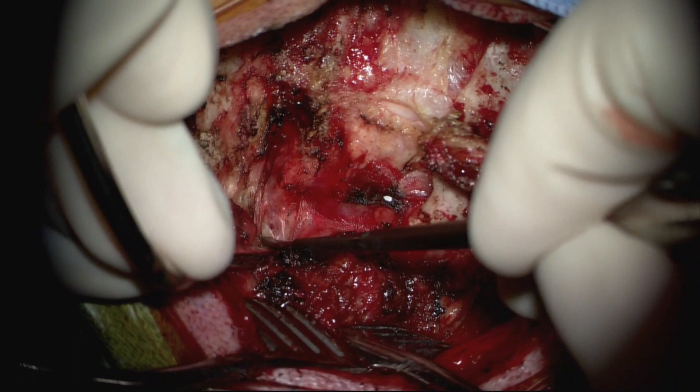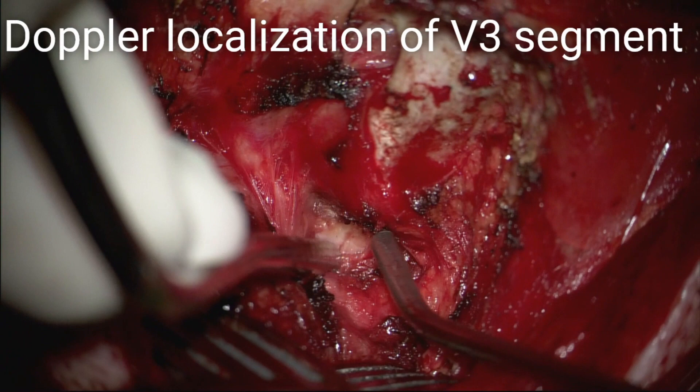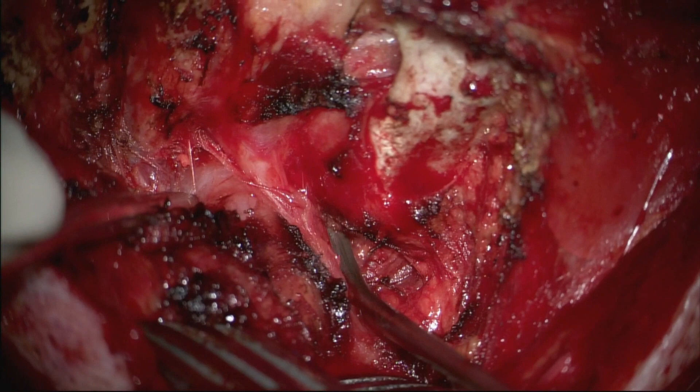Next, exposure of the C2 lateral mass is performed in a similar manner to the C1 exposure, with frequent use of Doppler localization of the vertebral artery to avoid iatrogenic injury.